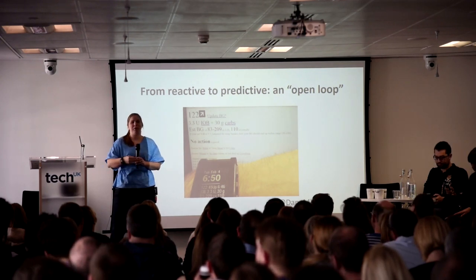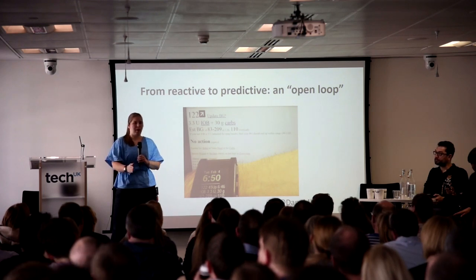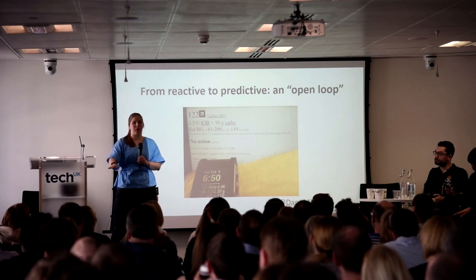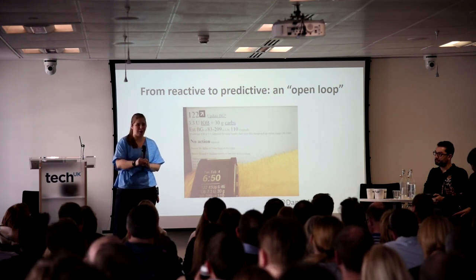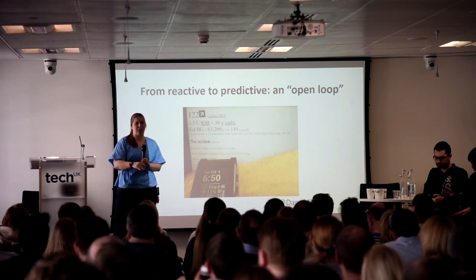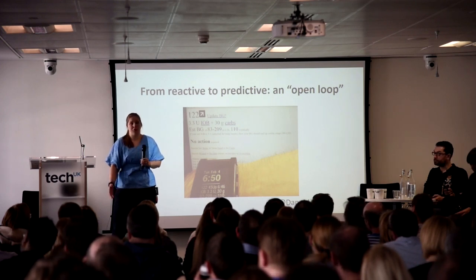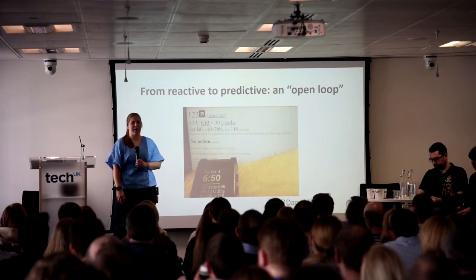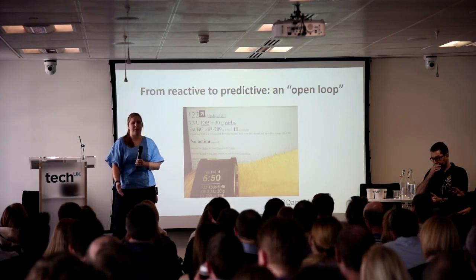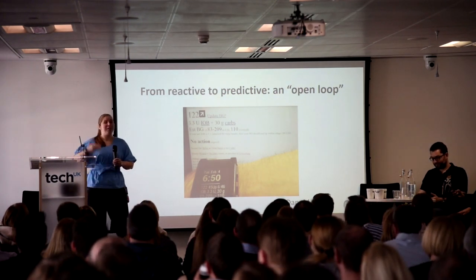We actually built a forecast into the future that said, not only here's what your blood sugar is right now, but here's what your blood sugar will be into the future. And that was beautiful because it allowed me to go from being reactive, you're low right now, take action, to, hey, in 72 minutes, you're going to dip down to 72. You might want to take action. Or hey, in 78 minutes, you're going to be 188. You're going to be 9. Sorry, my translation of numbers doesn't work that well. But you're going to be high, you might want to take action.